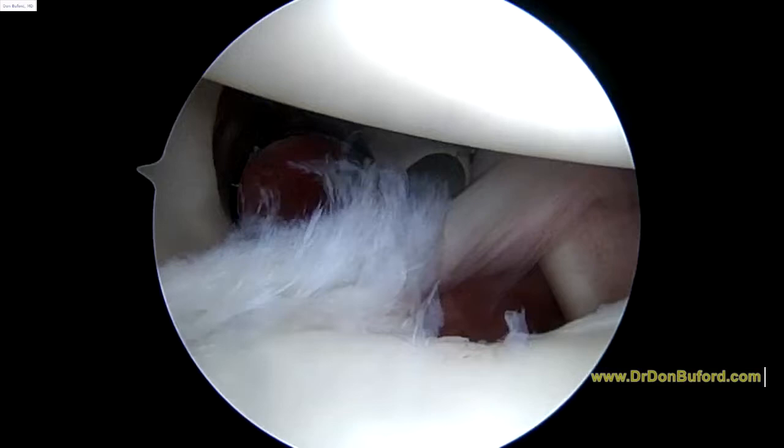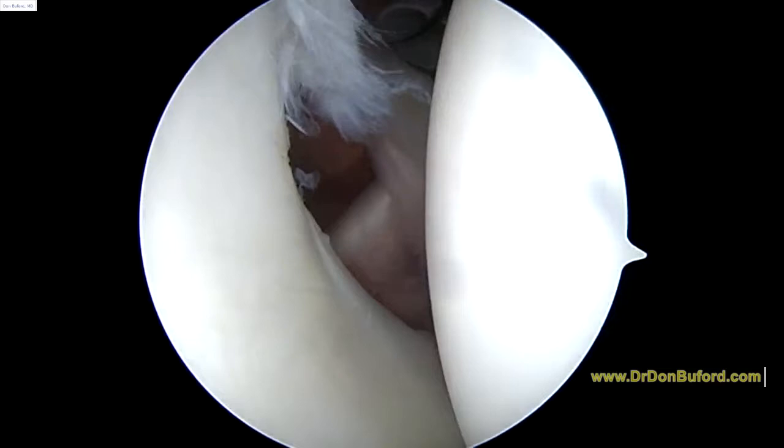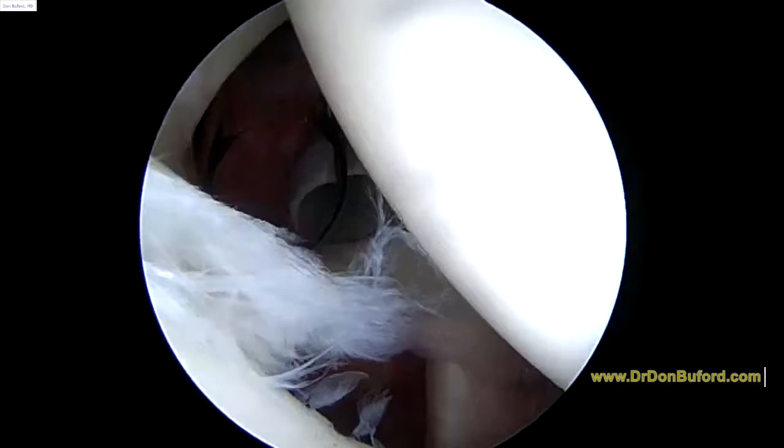What we're looking at right now is the biceps tendon on the screen. This is the biceps tendon here. You're laying on your side so your arm is up in the air. If we were actually doing this and you were standing in front of us, that would be your arm coming off to the right and that would be the biceps in the front. But we do this operation in the lateral position.